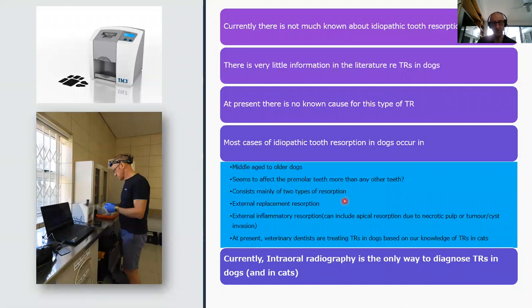It consists mainly of two types of resorption. One is external replacement resorption, which is a non-inflammatory type. Then we have an inflammatory type, or external inflammatory resorption, which is usually associated with inflammation of the gingival tissues at the crestal bone level around the cervical area of the tooth, or it can be associated with pulp necrosis and apical resorption. We can also see it with tumour and cyst invasion.